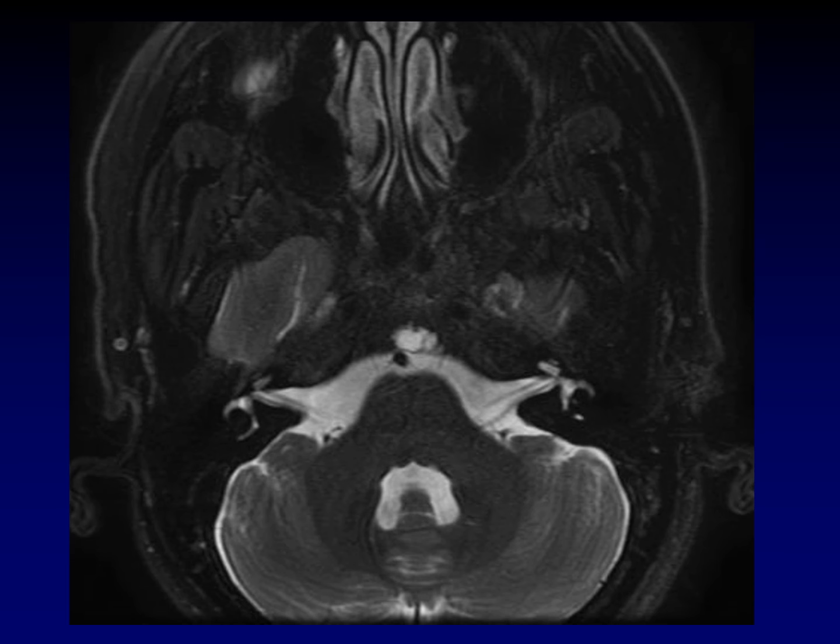If you ran into this image on a T2 weighted MRI of the skull base, here we have a pretty well defined T2 bright lesion that is cratering into the center of the clivus. This is a classic appearance for what we have called for many decades Ecchordosis Physaliphora.